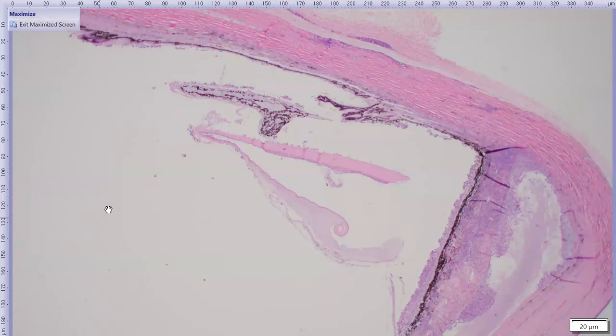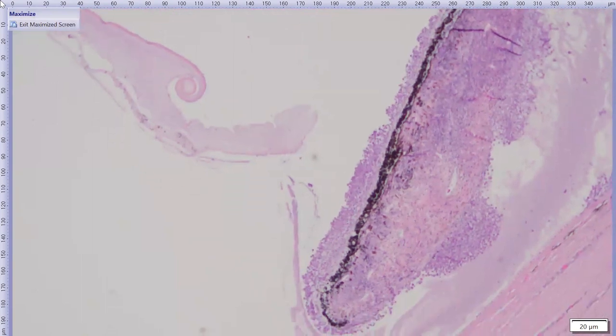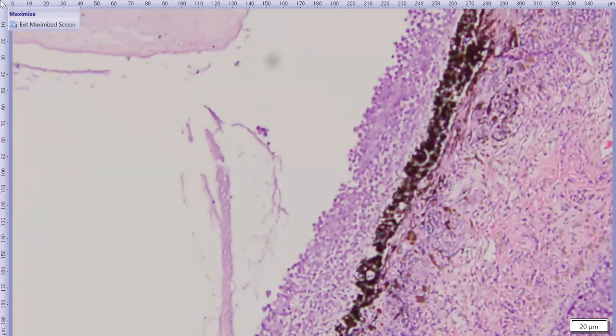The lens was sort of incompletely sampled in this case, but we do have part of the lens capsule here in the posterior chamber with this lovely curling of the posterior lens capsule, suggestive of a lens capsule rupture. And finishing off our tour, again, showing more of these cells carpeting uveal surfaces here. So I'm not going to go over the corneal disease too much. There's an ulcer there. It's probably associated with the exposure. We're going to focus on the stuff that is carpeting surfaces inside the eye.